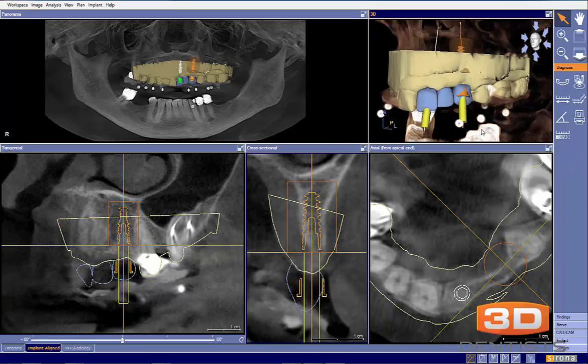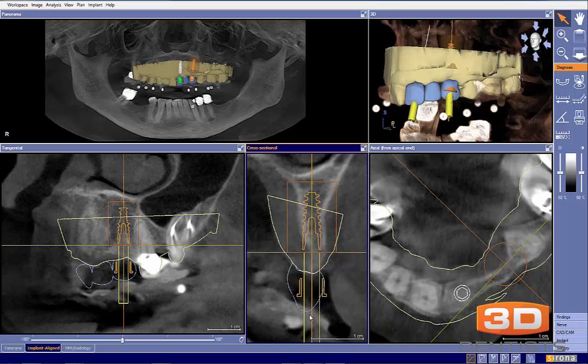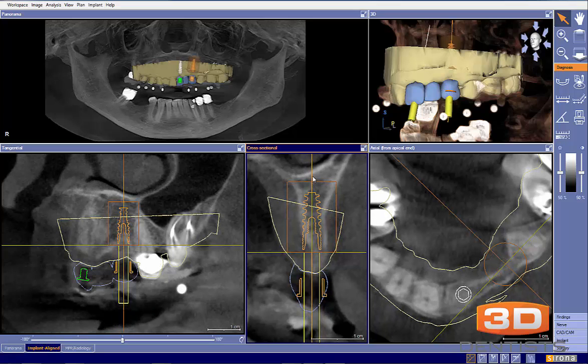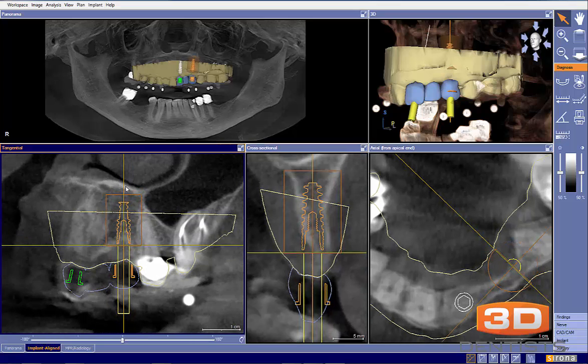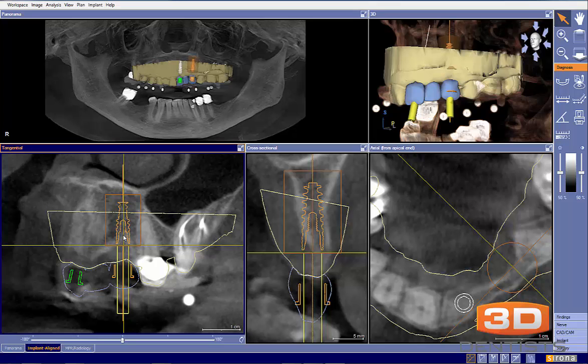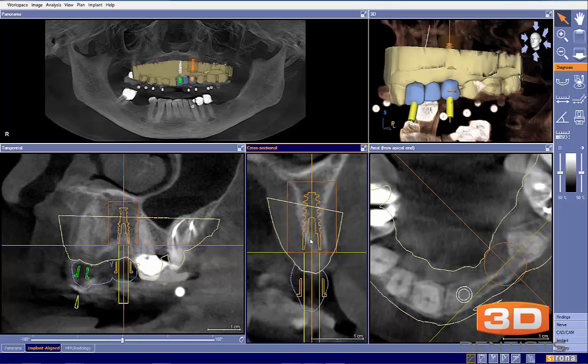Now I think on this one, I've already made the decision that we're going to need to do 2 custom abutments and a cemented bridge due to the implant angulations. And then my guess is going to be that this particular one, tooth number 11, is going to need some grafting to be done properly. So I would intend or plan on doing either some pre-implant grafting or some implant grafting at the time of placement, but based on this head position here, I don't think that's going to be all that easy unless you're comfortable doing a ridge split and bony expansion there.